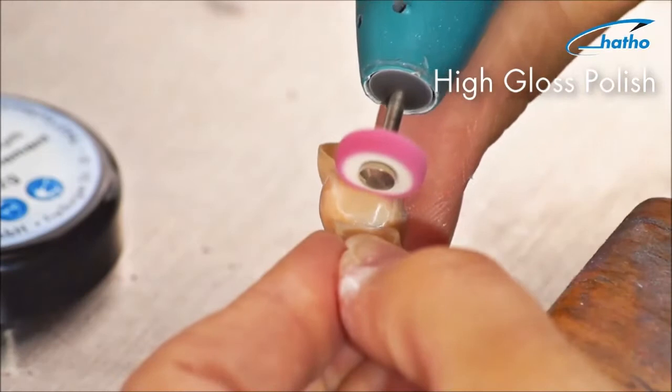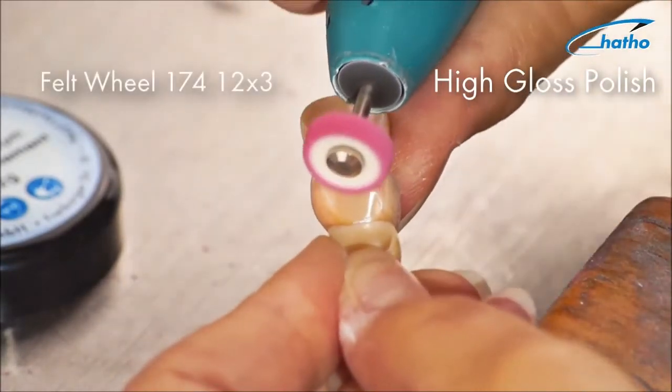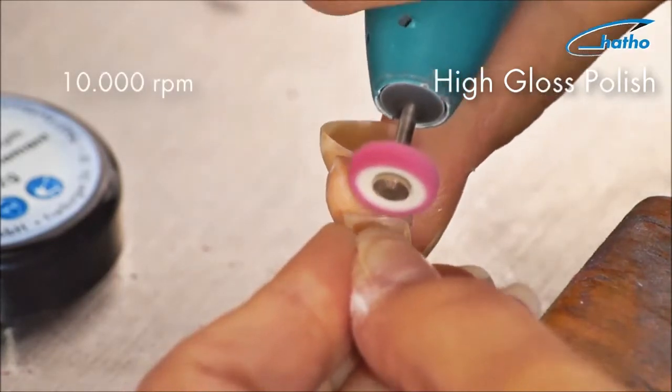For the zircon surfaces we recommend our felt polishers to achieve the best high shine. Felt in combination with the Polystar Pro Diamond can achieve a first-rate polishing finish.